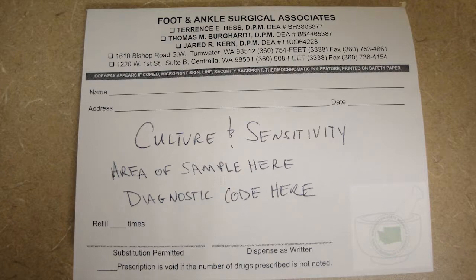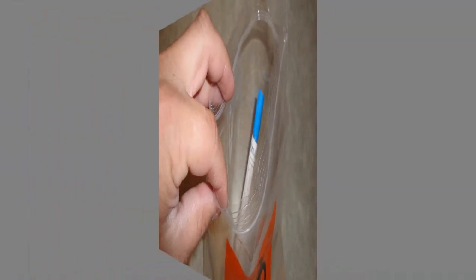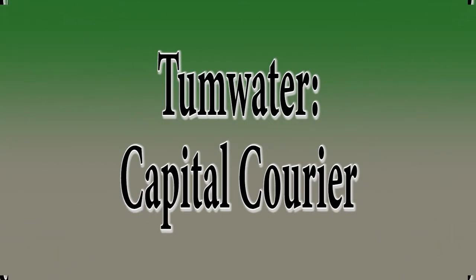Place the prescription and demographic sheet along with the swab in a biohazard bag, and you'll need to schedule a pickup. To do so, we use Capital Courier, so you'll need to call the number located at the nurse's station, and they will pick up the culture. Place the culture at the front desk to be picked up.